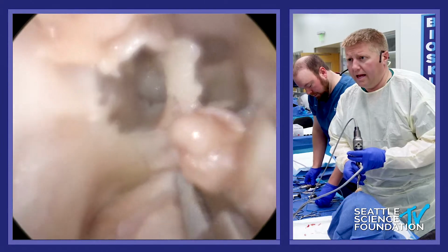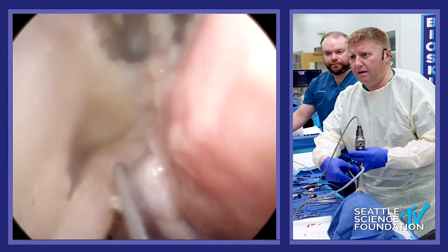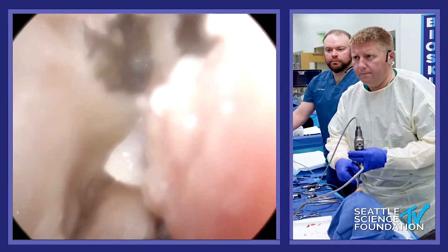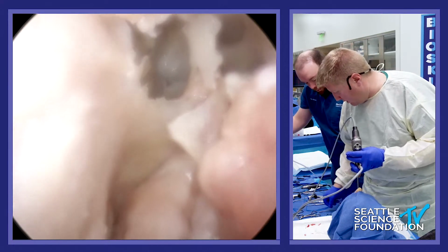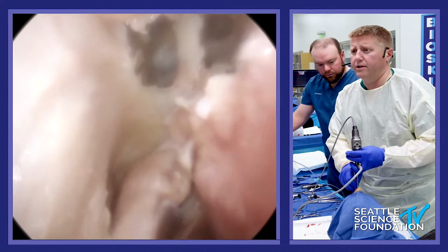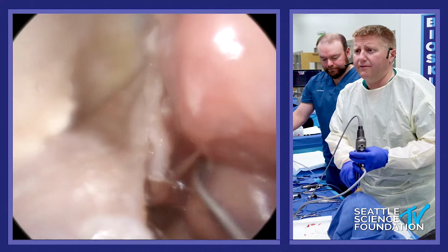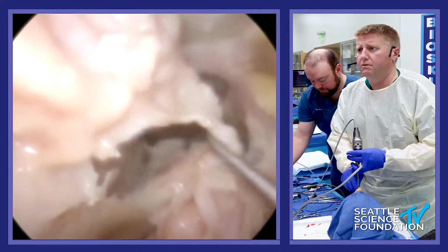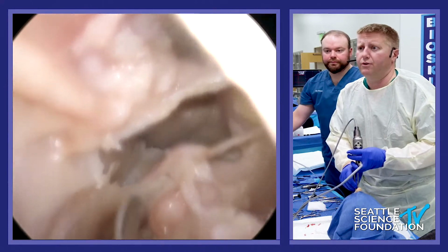So as we rotate that over, again, you want to make sure you get your inferior cut as well. And then as you're doing the case, you can tuck it in the nasopharynx for use later. It's safe there. I do always tell the neurosurgeon that I'm working with that, hey, it's there. Please don't rip it out if you're so inclined.